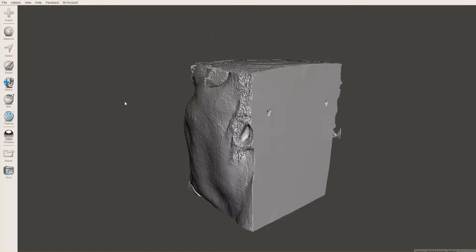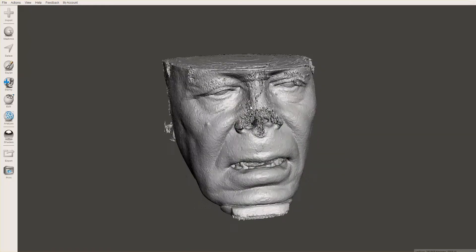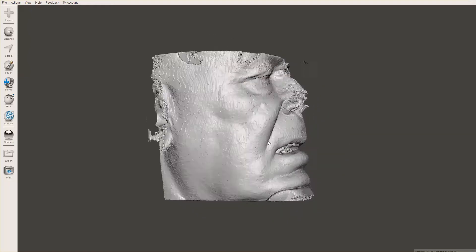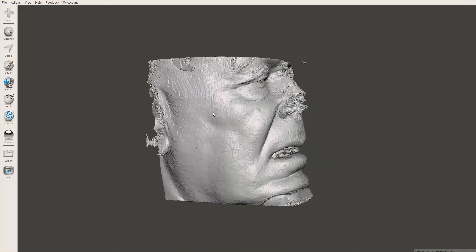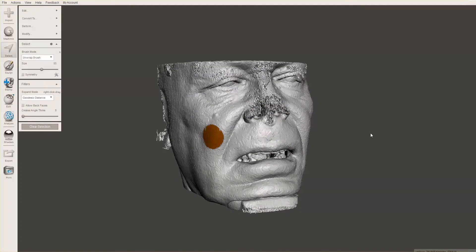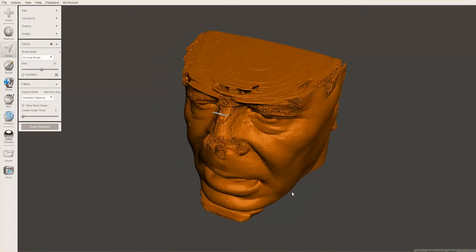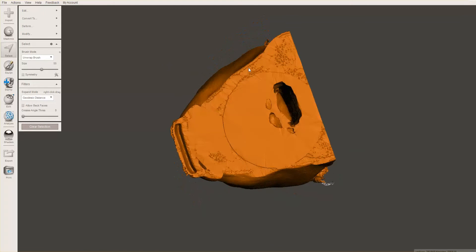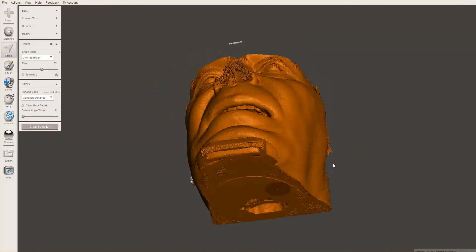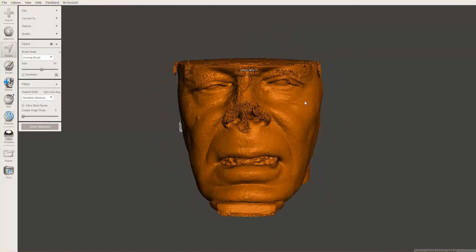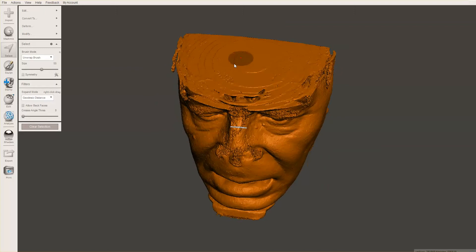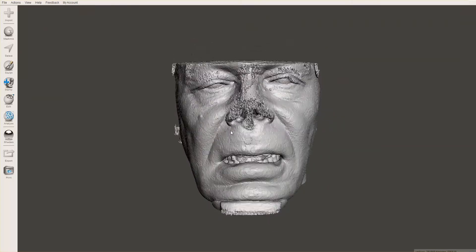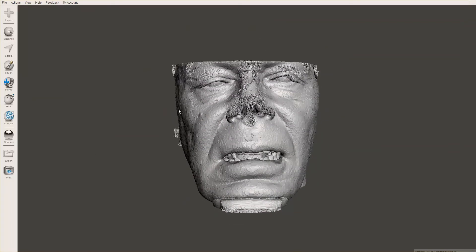And here you can see it. Again, it's just purely an STL surface. Now what I would love to do is click on this outer shell here and get rid of it all. But if I do that, if I just select that surface, because it's all connected, it highlights everything inside and out. And the reason is because it's all connected by these places on the top. So let me clear that. And what I need to do is first make a few cuts just to detach this.